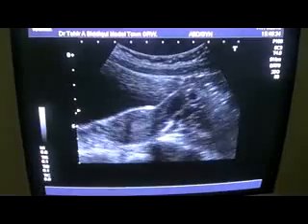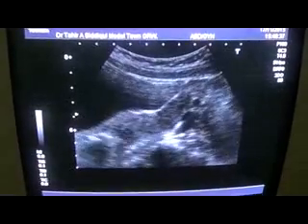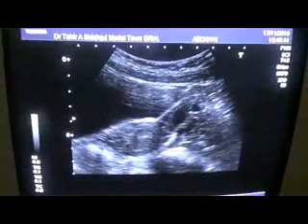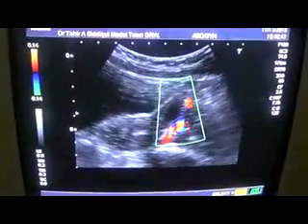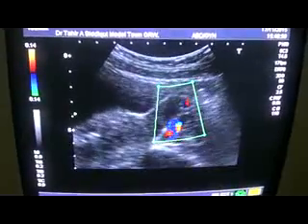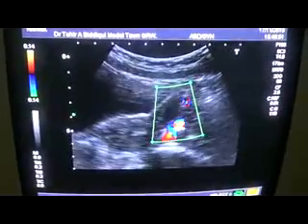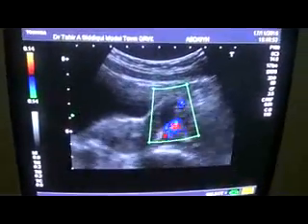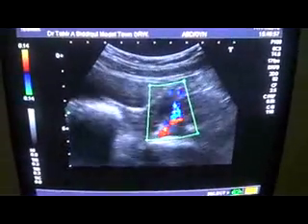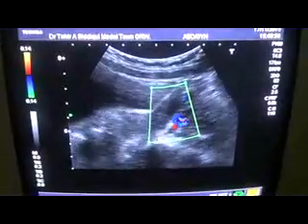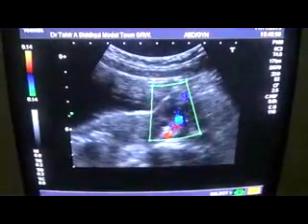On the left side, the same procedure as I did on the right side. You can see this is the left ovary, and you can see the developing follicles within.